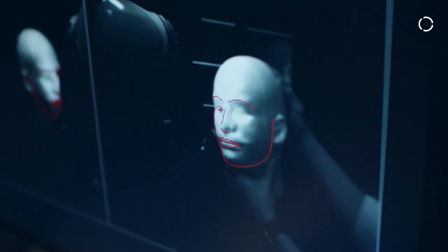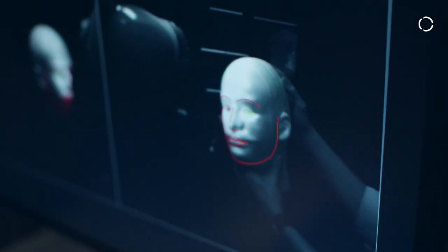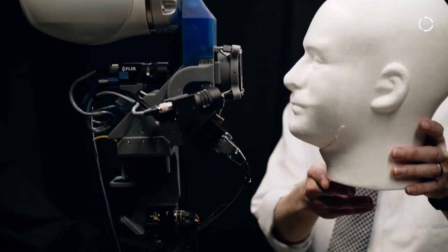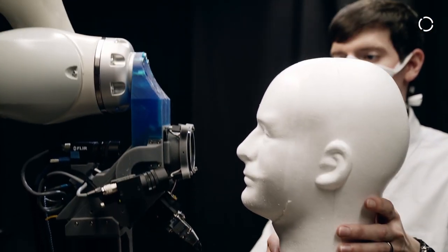The second main advantage of the system is that it has an active tracking scanner which means it can stabilize motion on the patient's behalf on the fly with optical elements. This eliminates a lot of the motion artifact you would see in a scanner that you normally need a chin rest to eliminate.